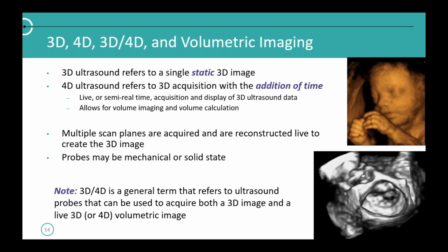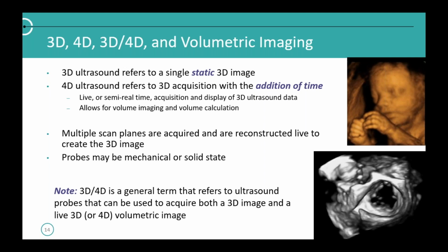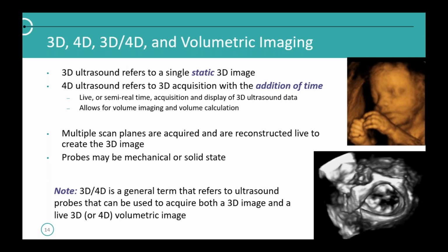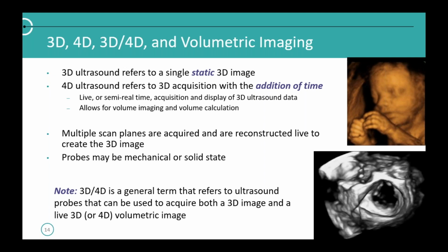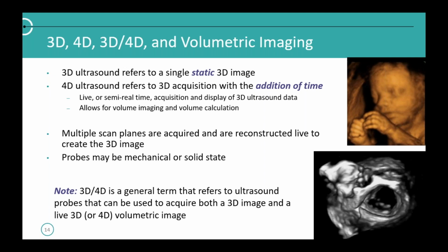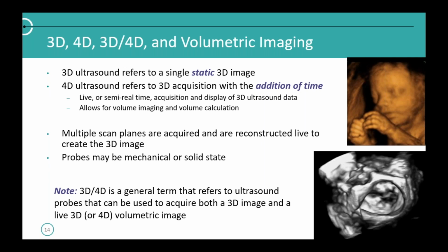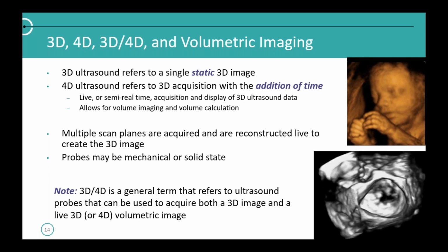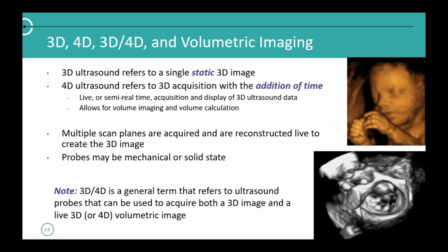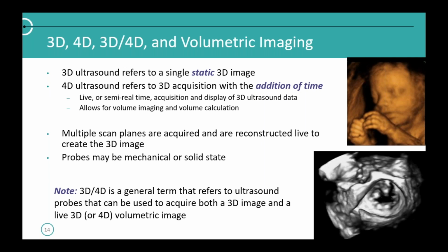And 3D, 4D is just a generic catch-all term that talks about probes or the technology. With 3D imaging, I mentioned here, you could have solid-state probes where everything is purely electronic, or you can have the old-school mechanical probes. And I had one at the desk today. Thing has a motor in it, and the array or the crystals wobble back and forth.